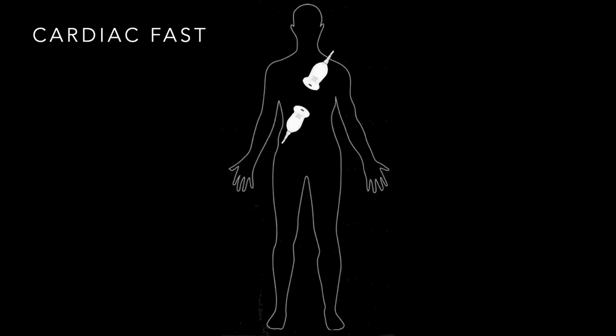So the next part of this is the cardiac portion of the FAST. And we talked about that last week. And that's the additional, that fourth window in the traditional FAST exam, where we're looking to see basically two things. Is there fluid surrounding the heart in the pericardial space, right? In the setting of trauma, it's assumed to be part of the trauma. And then is that heart beating, yes or no? You can nuance it to how well it's beating, but really in the setting of the FAST exam, is it beating and how much fluid's around that heart?